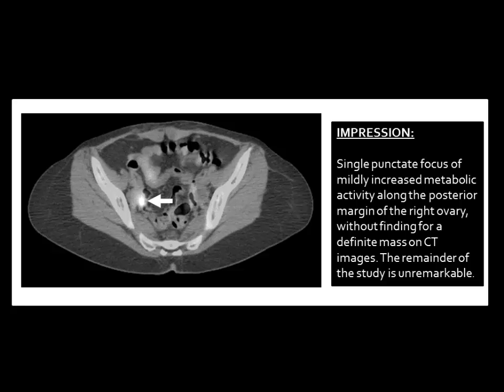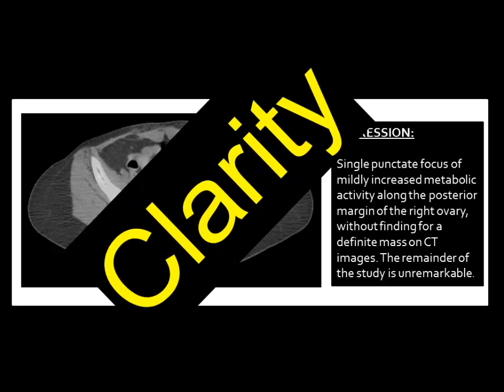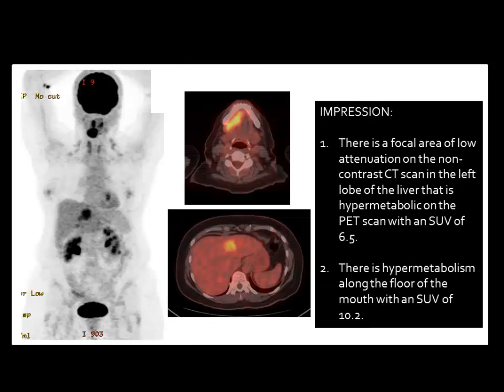denotes. Do we think this is merely just physiologic activity in a young woman? Is this potentially a primary ovarian carcinoma in an older female? We've really not given any guidance, and so this is really a lack of clarity in this case. We've not conveyed what our meaning is.